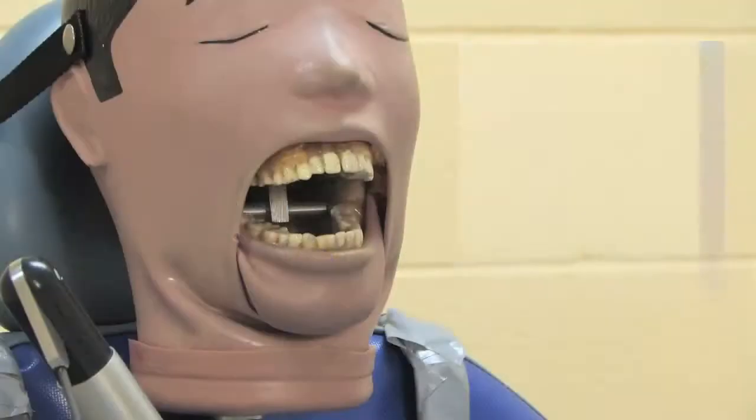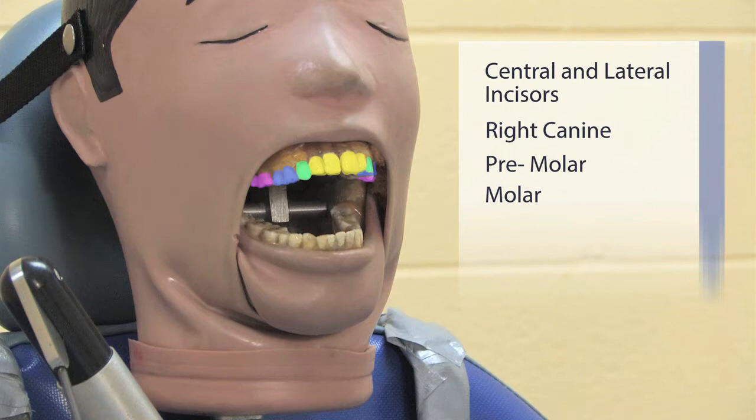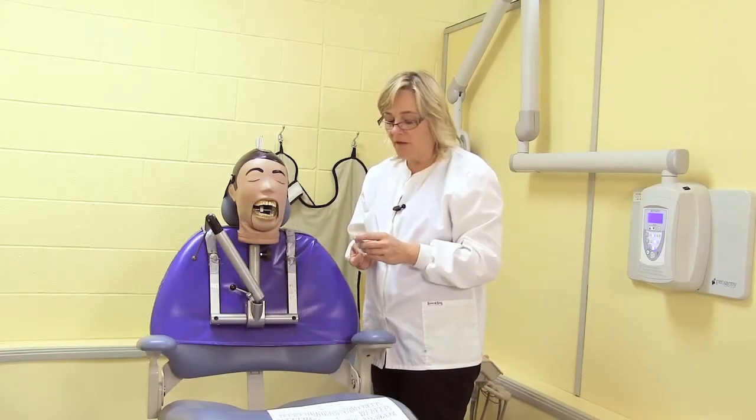I'll start with the stabe bite block because the radiographs that I would be demonstrating in the anterior would be the central and lateral incisors, and for our purpose today I would do the right canine. Then I would do the premolar shot and the molar shot on the right side. The technique is the same for the left side, so in order to not be redundant, I will continue just with the right side.